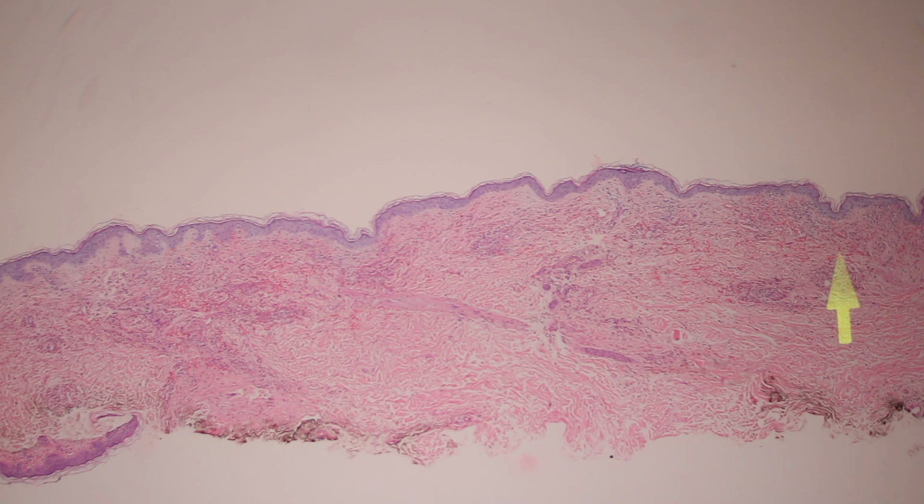The way to tell that apart is by direct immunofluorescence and also the clinical symptomatology. So most of the time when kids have vasculitis, the majority of it is going to be Henoch-Schonlein purpura. So when there's a suspicion for that, our dermatologists will usually do a second biopsy and they'll put it in Michel's media and they'll send it for direct immunofluorescence.